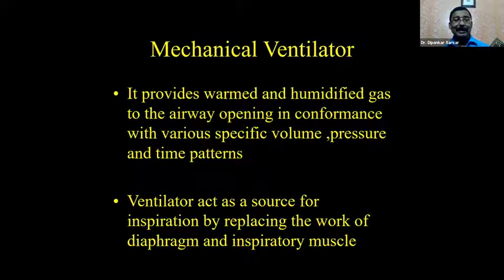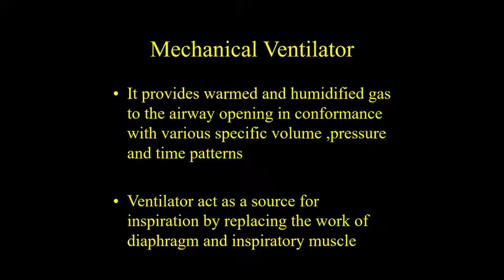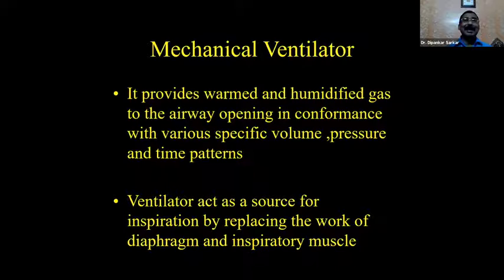A mechanical ventilator provides warm humidified gases. And the ventilator acts as a source of inspiration by replacing the work of the diaphragm and inspiratory muscles. That's the crux. So it gives oxygen, takes out carbon dioxide, and supports the muscles of respiration. If any of these three is in problem, we call it, in a mix-and-match way, respiratory failure. And we use the terminology type 1, type 2, type 3, type 4, depending on these four variables.